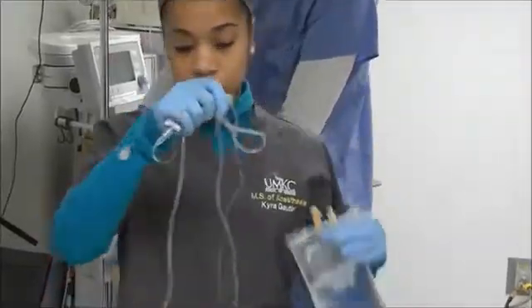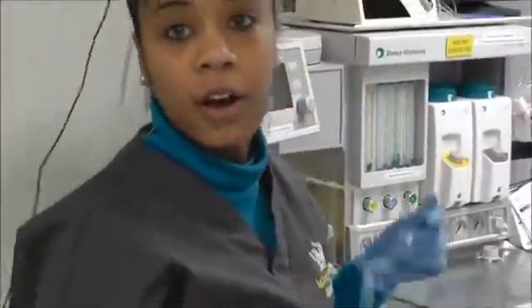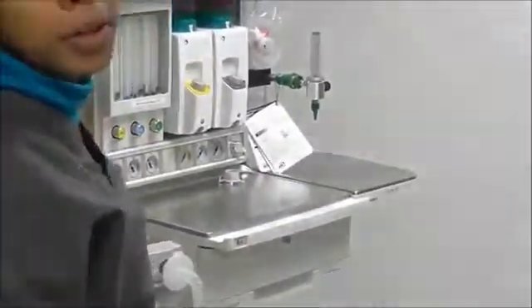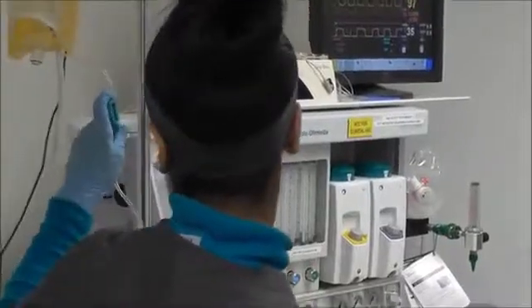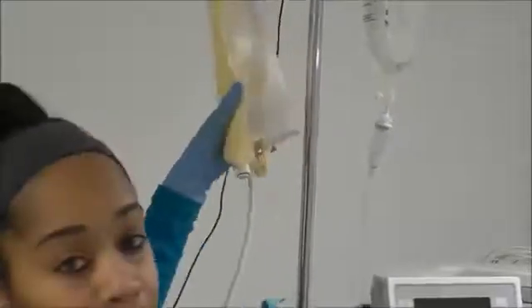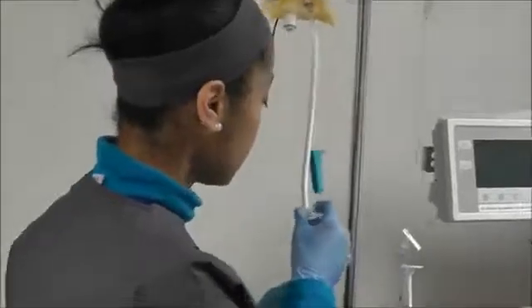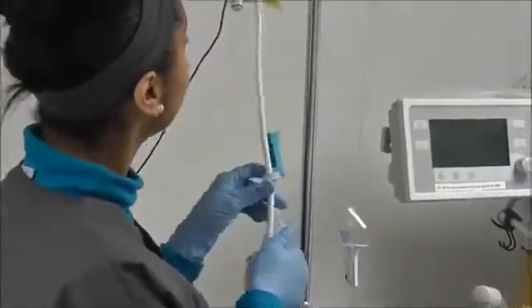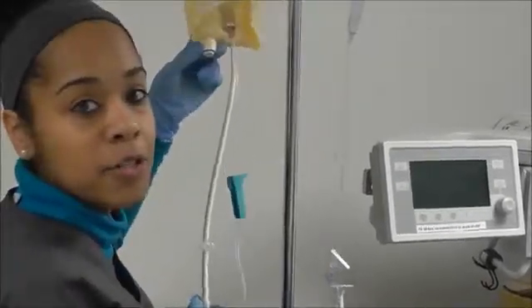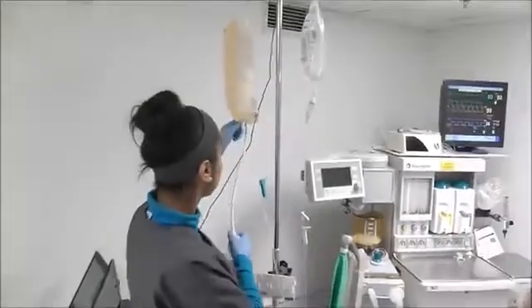First thing you want to make sure you do is flush your tubing. First thing you want to make sure is that all your stopcocks are turned on in the right spots and that your roller clamp is open. This bag has to be pressurized. So first you want to blow up your pressure bag. Alright, stopcocks in the right spot. You want to pressurize to about 250 to 300. We're at 300. There's a green line that lets you know you're at 300.